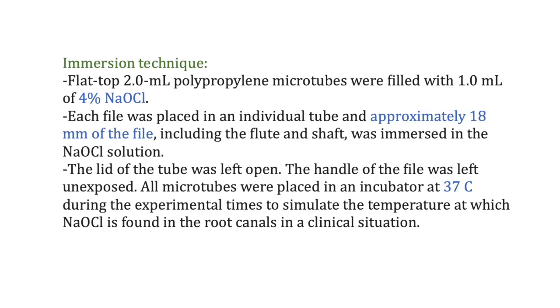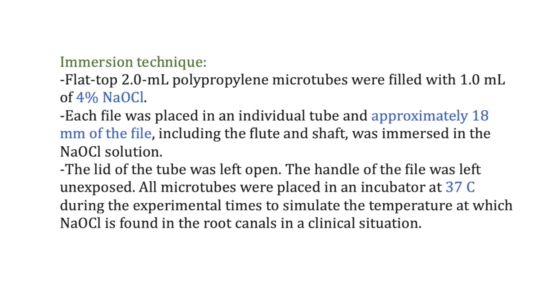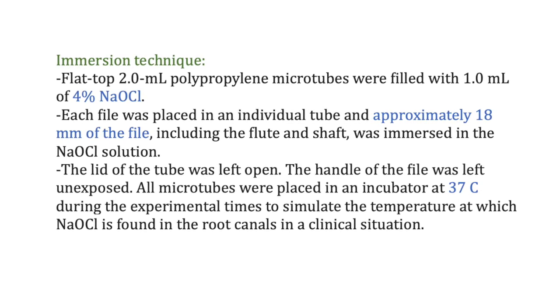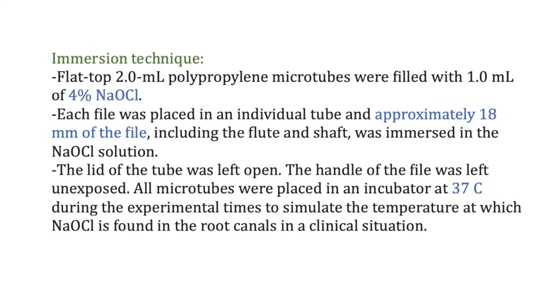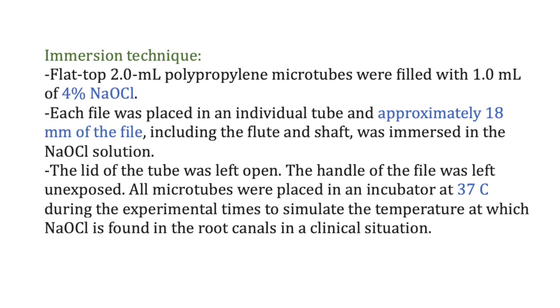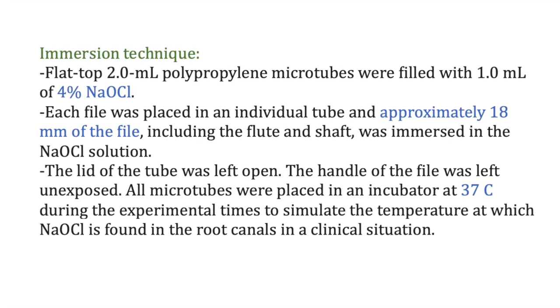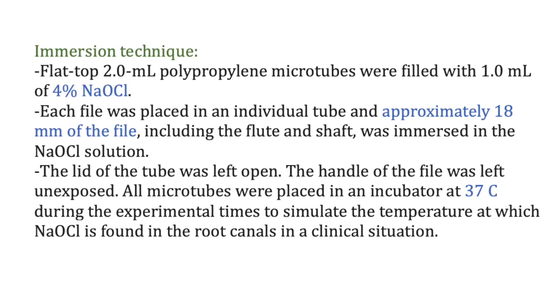Flat-top 2 ml polypropylene microtubes were filled with 1 ml of 4% sodium hypochlorite. Each file was placed in an individual tube and approximately 18 mm of the file was immersed inside the solution, including the flutes and the shaft. The lid of the tube was left open, and the handle of the file was left unexposed. All microtubes were placed in an incubator at 37 degrees during the experimental time to simulate the temperature at which sodium hypochlorite is found in the root canal in the clinical situation.